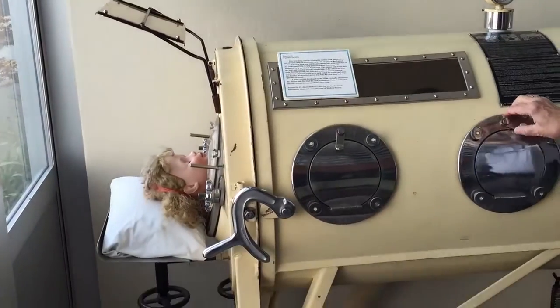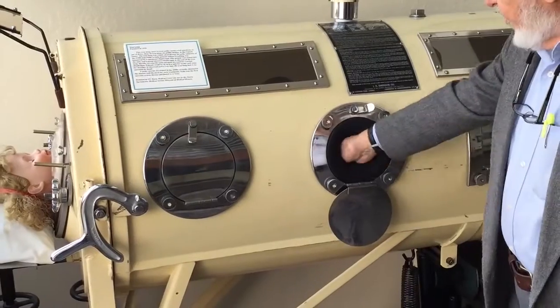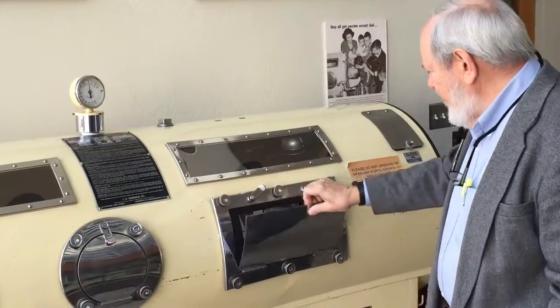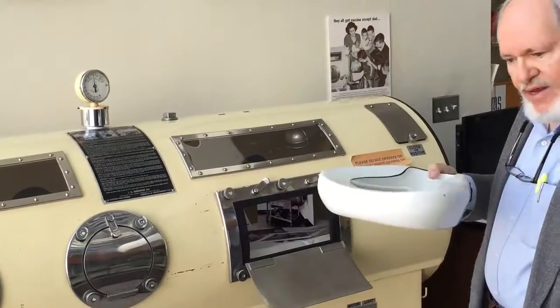If they needed care or bathing, the nurses would go ahead and use these airlocks, which would seal around the wrists so it would not interfere with the patient's breathing. And of course, for other purposes, they would use this port and insert a bedpan as needed.